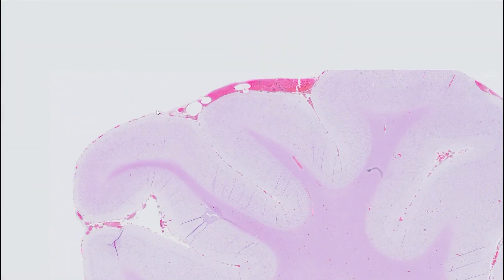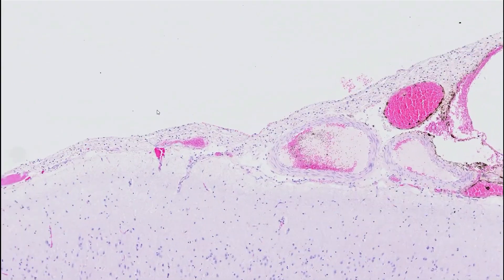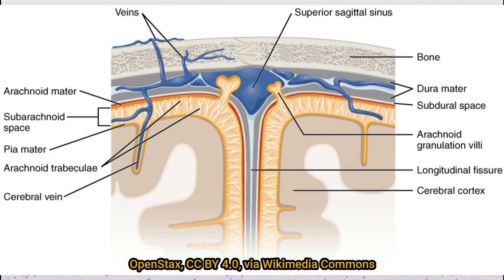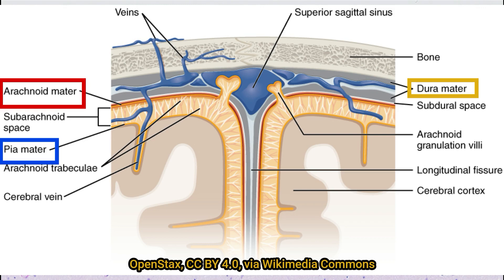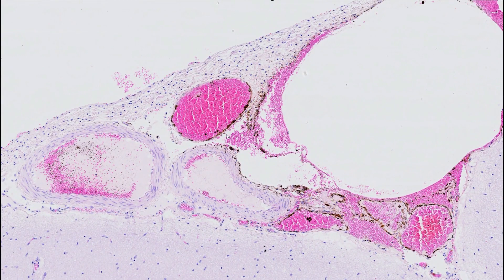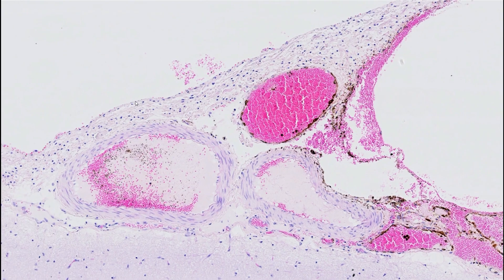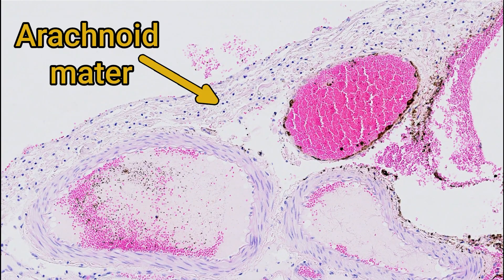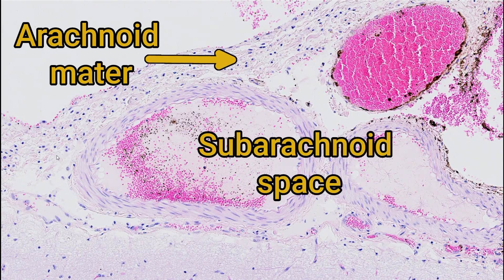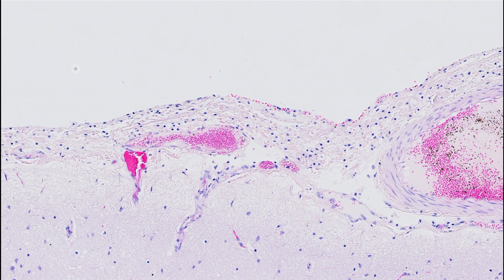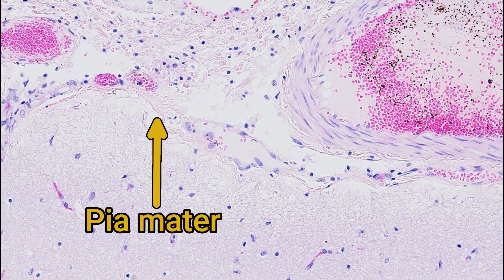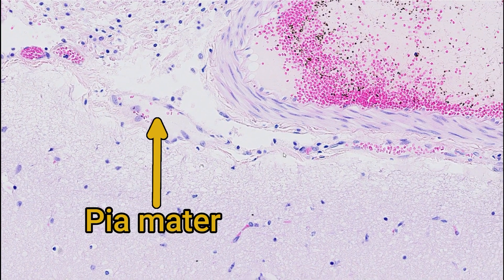If we start to look at things at a higher power, we can move from the outside towards the inside. Encasing the brain, there are the meninges. If you remember from your gross anatomy, there are three meninges: the dura mater, the arachnoid mater, and the pia mater. The dura mater is often not present on slides because it comes away easily, whereas the arachnoid mater and the pia mater are much more firmly attached. The outermost layer of collagen and connective tissue is the arachnoid mater, and then below that there's the subarachnoid space, which often has blood vessels, some of them quite large. Adhered to the brain is the pia mater - all of this collagen here just adhering to the grey matter underneath.